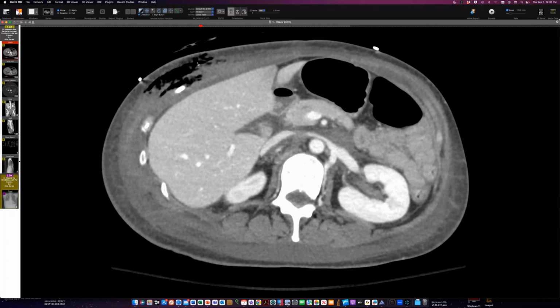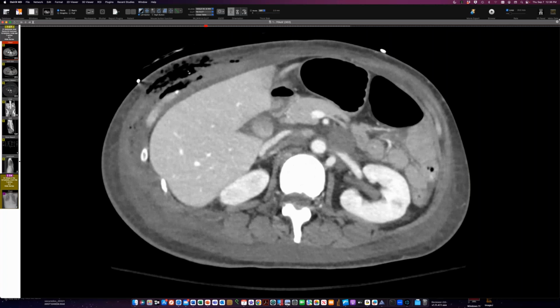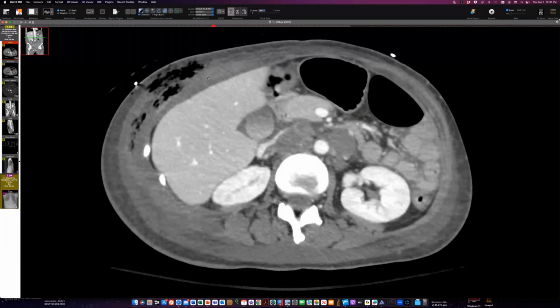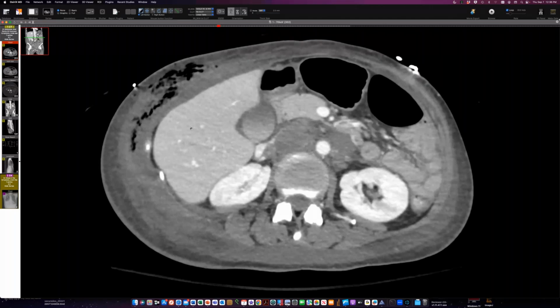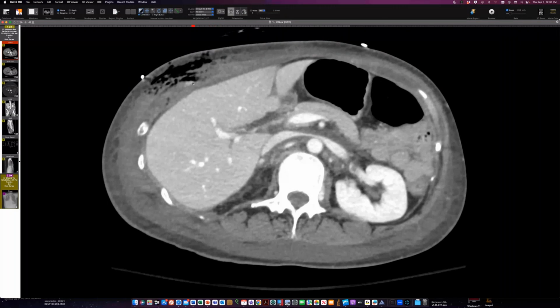And every time I show a bronchopleural fistula with a gas collection as part of an empyema, people say, well, that could be a gas forming organism. So this is a case where you do have a gas forming organism that is causing the black stuff, the gas, but in the setting of bronchopleural fistula and empyema, it's almost never a gas forming organism. It's usually bronchopleural fistula. There's a hole in the pleura, or it's some intervention with a needle or a tube that has led to the gas collection. So this case, we actually do have a gas forming organism, but that does not apply in any empyema that I've ever seen. People bring that up because of thinking about clostridial infections as a cause of gas in soft tissues. That does not apply in the empyema situation.